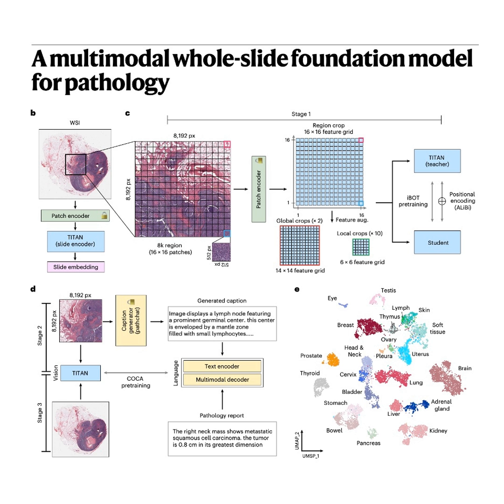On this really challenging task, OT108, which is all about rare pan-cancer subtyping, Titan blew the other encoders out of the water. So what does that mean in practice? Functionally, it means if a pathologist discovers a new, extremely rare cancer variant, they might only need to feed Titan a single example to begin classifying it reliably. That could drastically accelerate diagnosis. That immediately saves lives and research time.